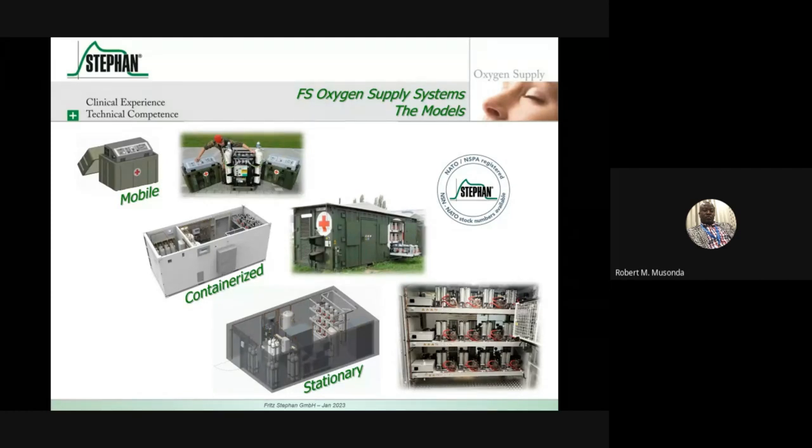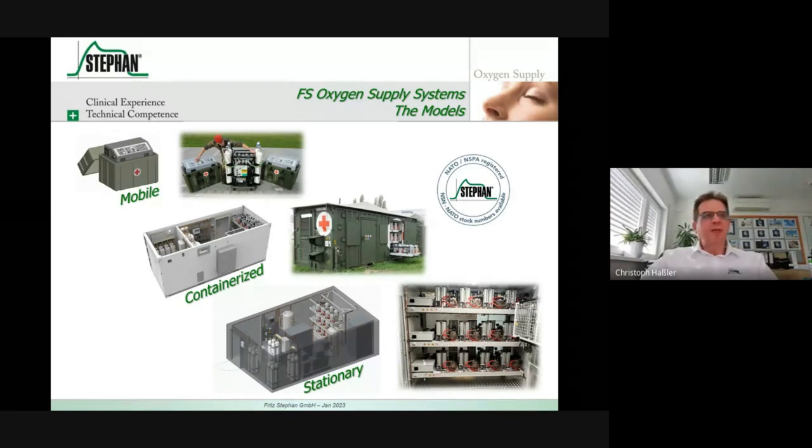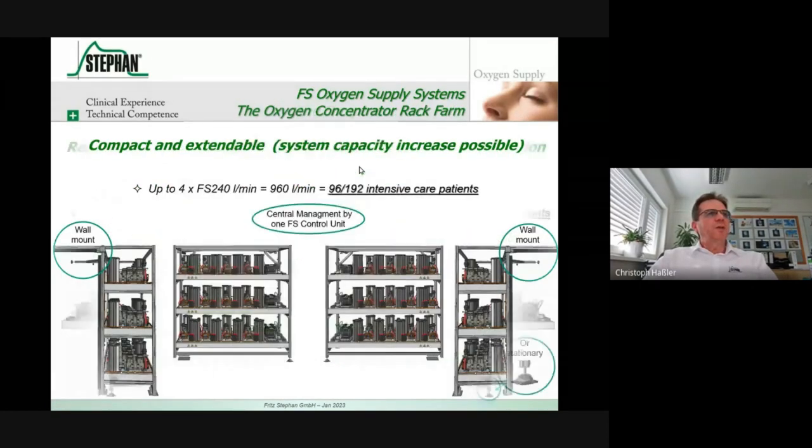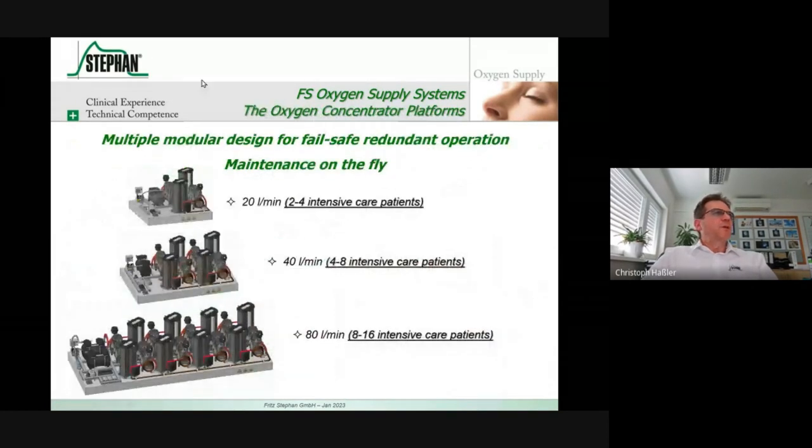It's also a question about preventive maintenance, meaning how often you exchange those little filters there. And by the way, I haven't mentioned that those filters can be changed even without a screwdriver, very easily by hand. Those are these little filters here, which you can easily open and replace. If the filter is dirty and dust comes in, dust and water are the biggest challenges to the concentrator modules.